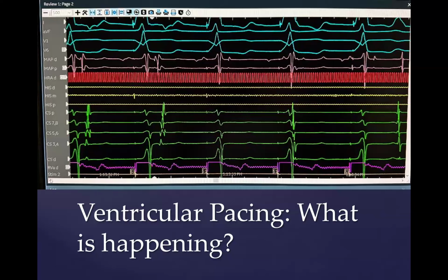One of the big advantages of CARTO, which is a major advance, is that CARTO is recording everything continuously. And so with CARTO, we can actually see where the catheter was at precisely the moment that the pathway was no longer visible, meaning the pathway had been bumped.